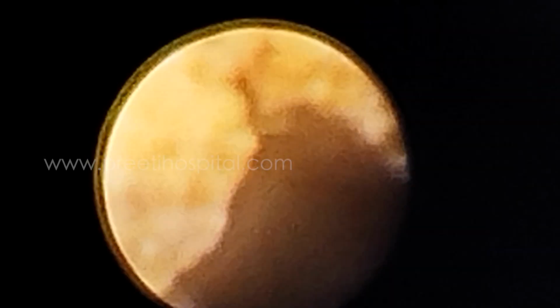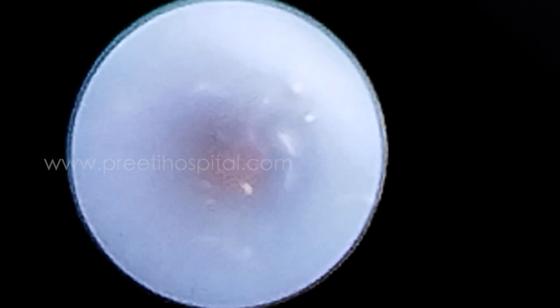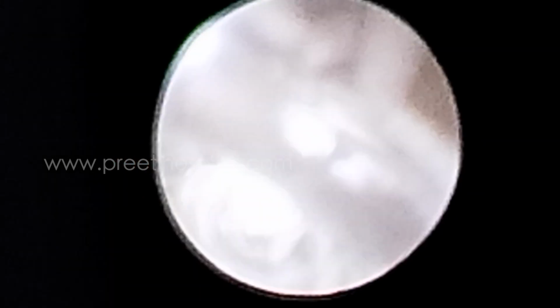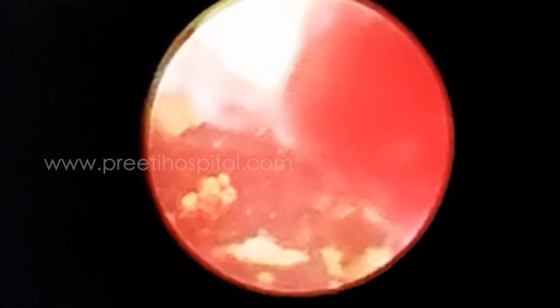Now you see all these fragments, because you are flushing continuously, will they go into the ureter? No, sir. So that is the advantage of supine PCNL, and prone also same. But in supine PCNL generally they don't go down. In prone PCNL they go. So pelvis is a little anterior, here it will be anterior. That's why in supine PCNL puncture, all these you should remove. They should not be made powder. If you make powder, they will form stone again. That is the thing. You got the point?